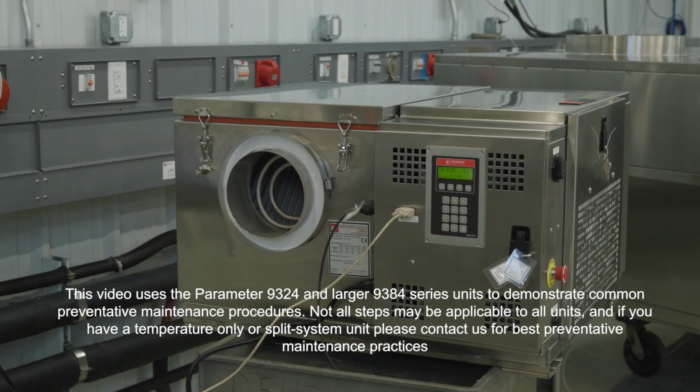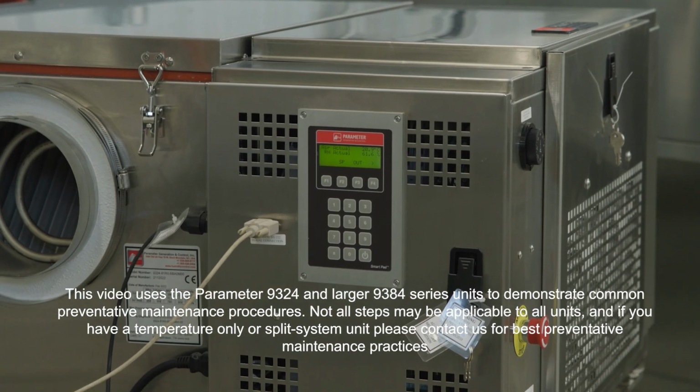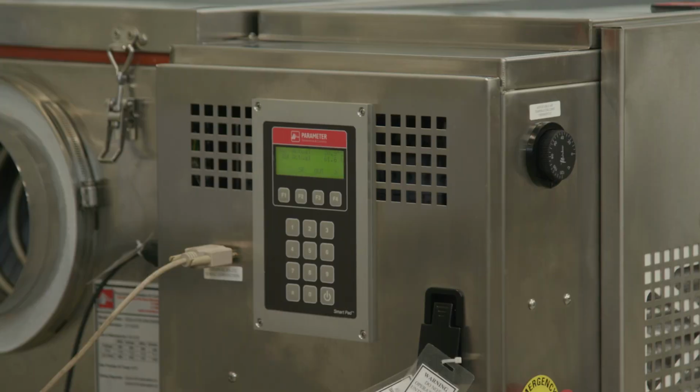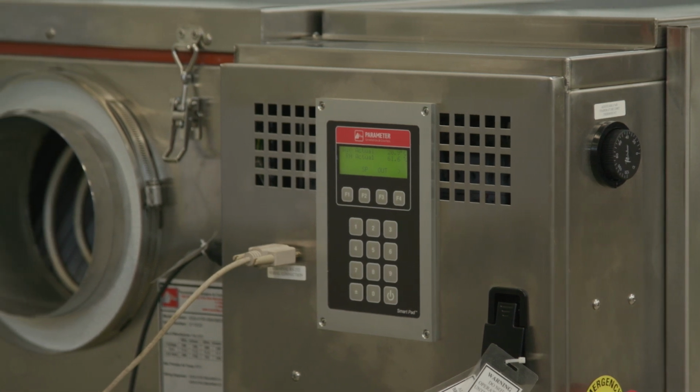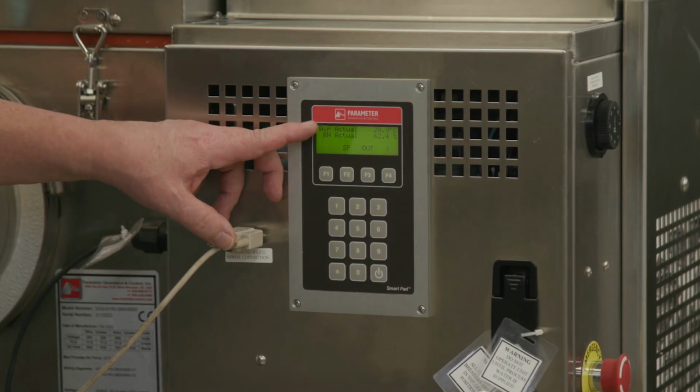This video will take you through common preventative maintenance procedures for parameter conditioning units. Here we'll cover basic verifications, in-depth technical inspection processes, cleaning, and periodic maintenance procedures. Start by making sure the unit is on and operational.